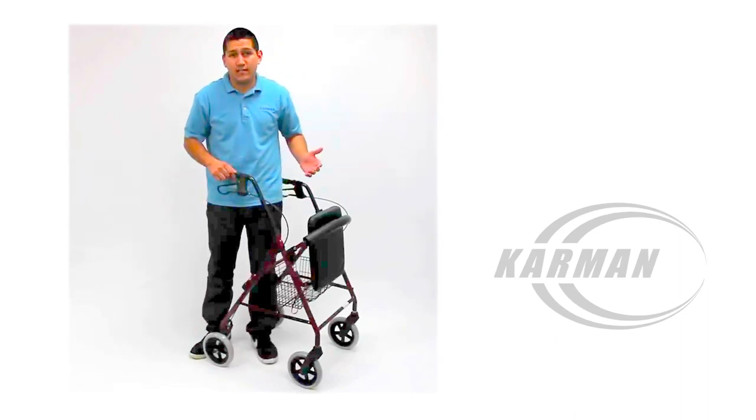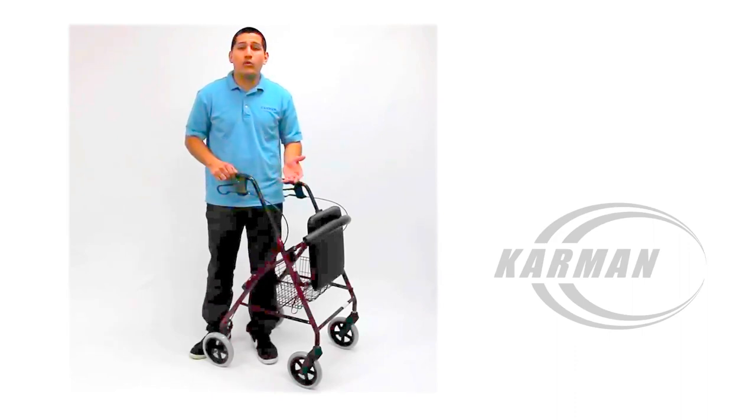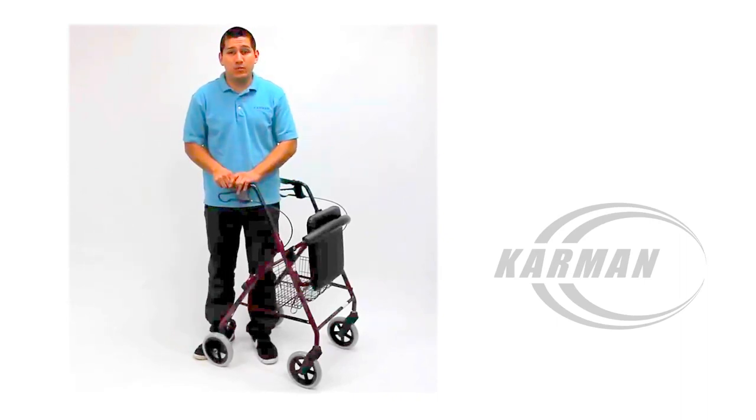This Rollator is intended for a user of about five foot one all the way up to six foot two inches. For any further questions, please visit our website at www.KarmanHealthcare.com. Thank you.